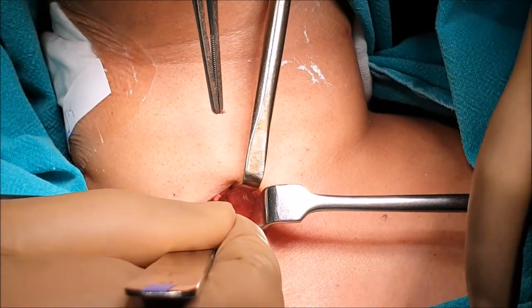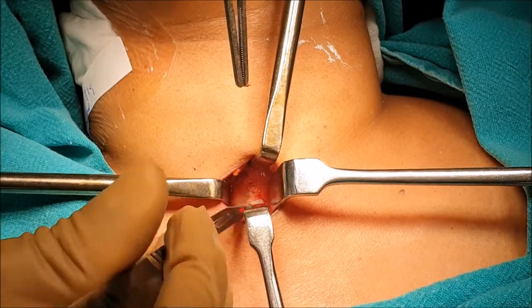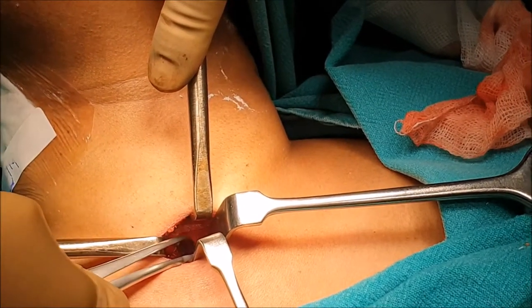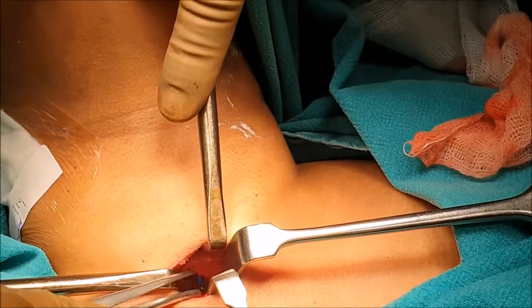With the help of an eleven number blade, the trachea is opened in between the 2nd and 3rd cartilage and the incision is deepened. With the help of a tracheal dilator, the opening in the trachea is dilated and widened.